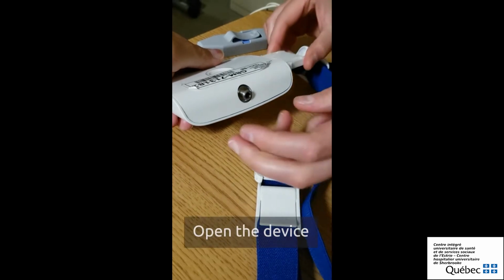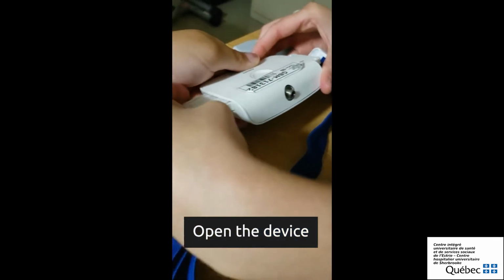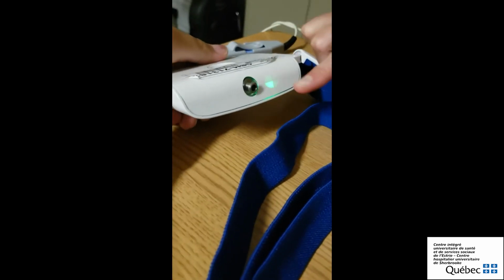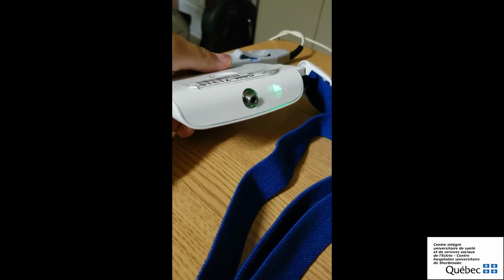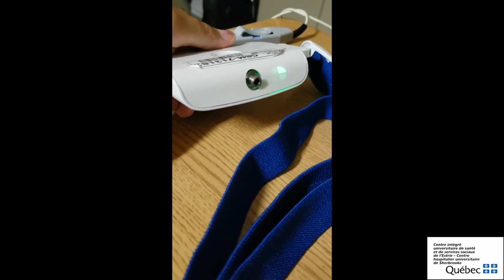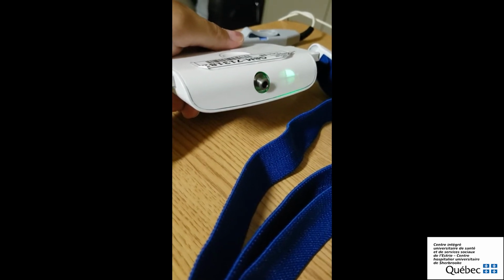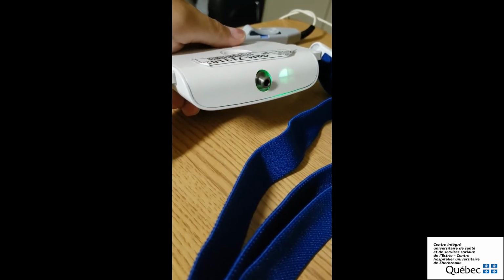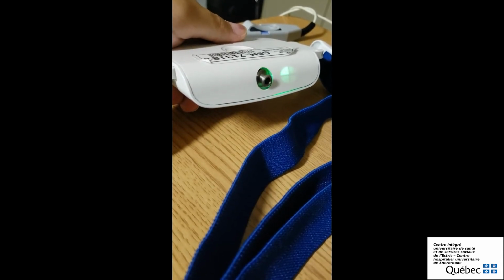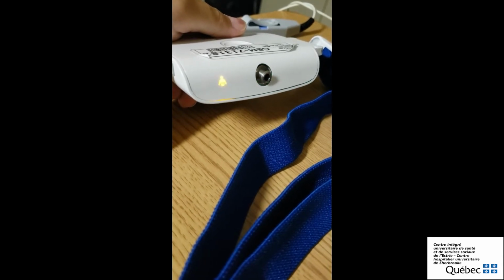When we connect the chest band, the machine will open without any help. Here we see a light that says the machine is starting. You will see the 4 quarters light up. It means that 100% of the data is being saved. If during the night you see 1, 2, or 3 quarters light up, it is a sign that there is a problem with the recording and that something is misplaced. If this is the case, you need to check to reposition everything correctly.